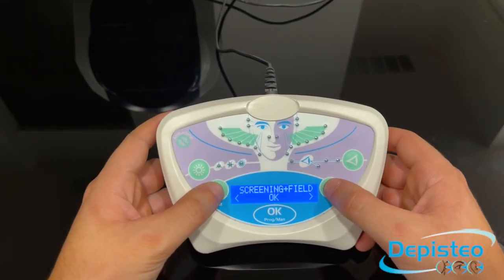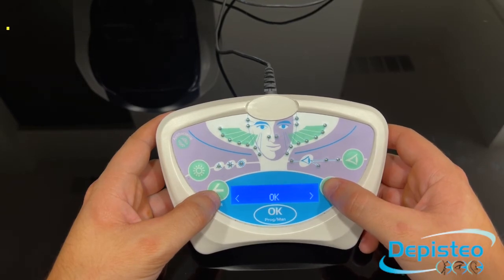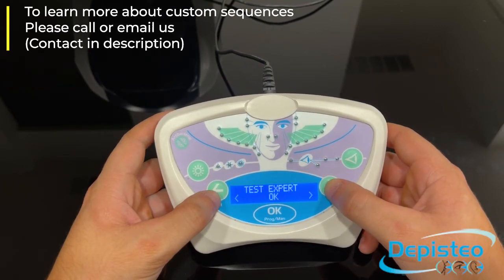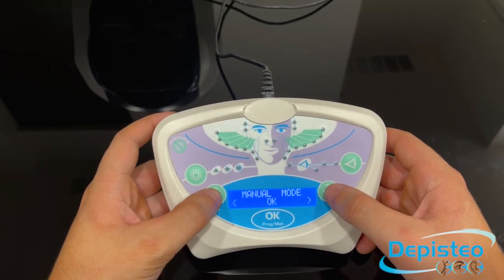You can navigate through the main menu using the left and the right arrows. Here you will find pre-programmed sequences as well as a customized sequence if you have one. For this video, we will select the manual mode, which is the mode that includes all of the tests.